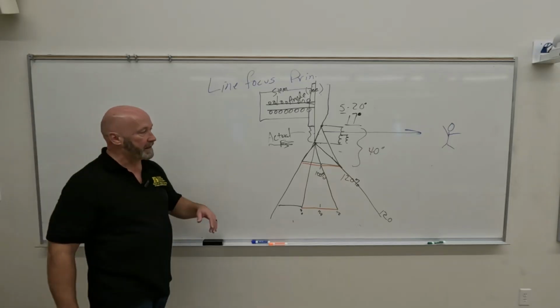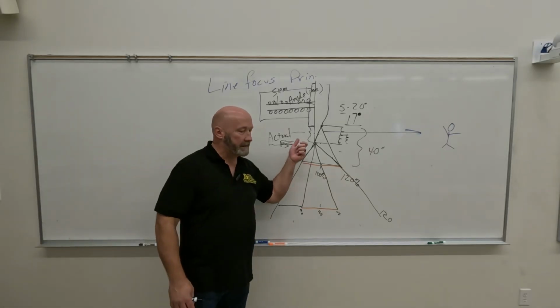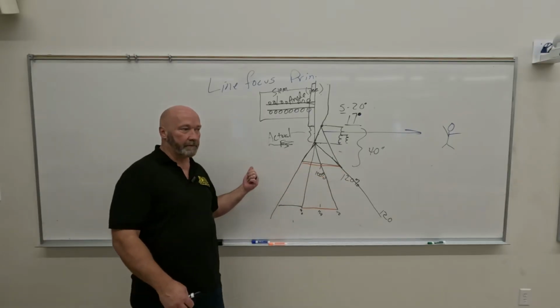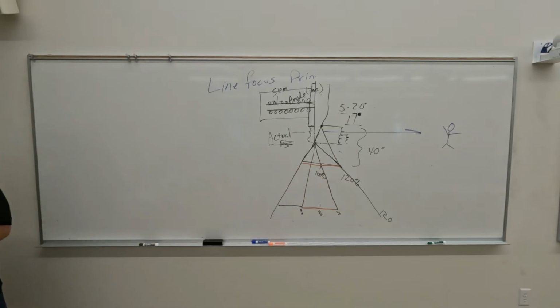The intensity difference is worse at low SIDs, but it's always present. Cathode end always more than anode end. Right?